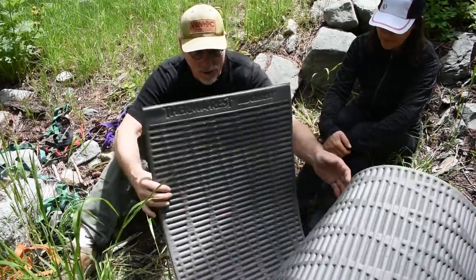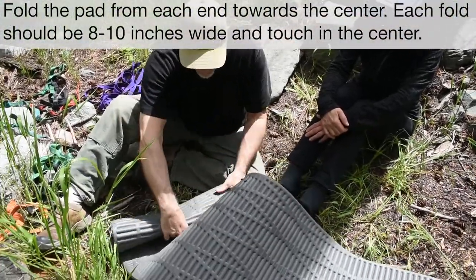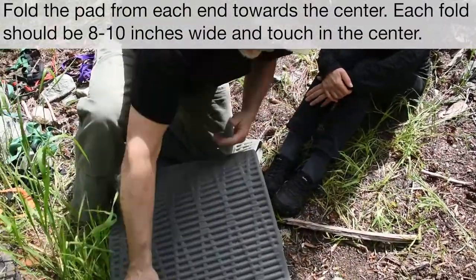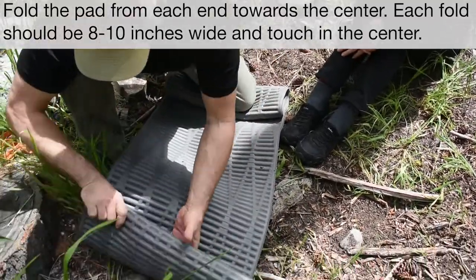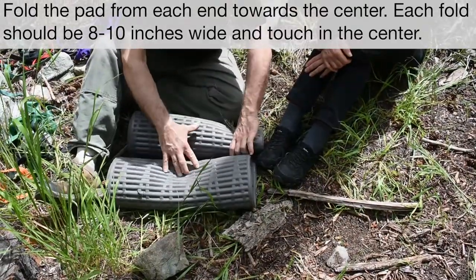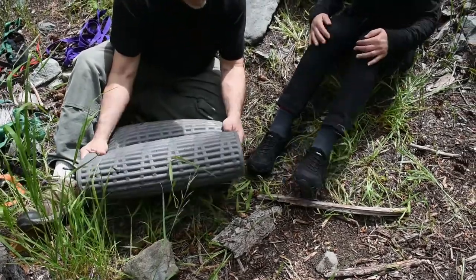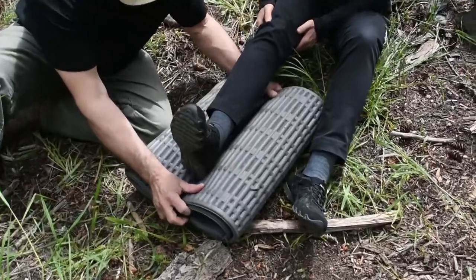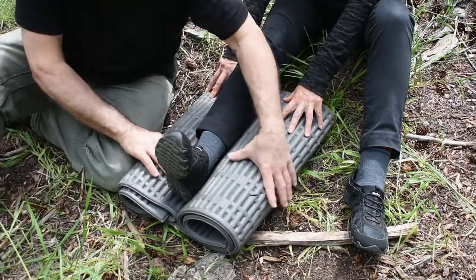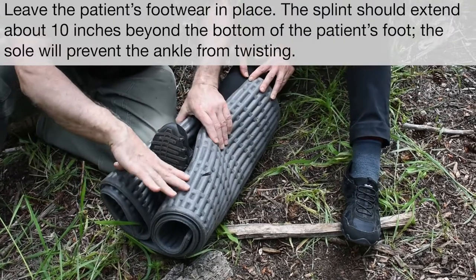The first step is to fold each side of the sleeping pad up a little bit. We'll splint Lena's ankle here — have the ankle sit right down in, and you want it to go beyond the edge. You want this splint to go beyond her ankle.